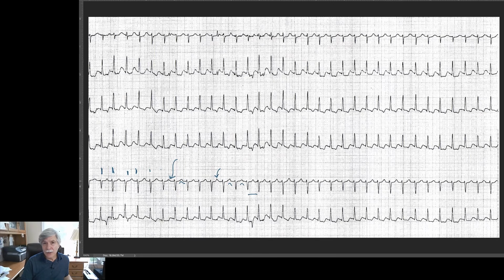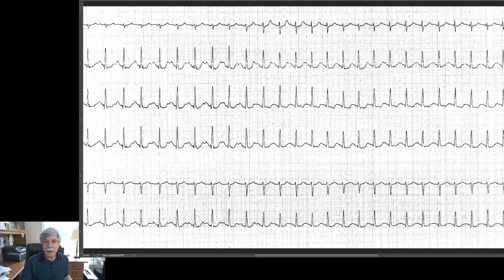But for the usual variety, the common form, what's also known as slow-fast, going down the slow and up the fast pathway, it's generally regular like a clock. So I was like, let's see what happens in a minute or two. And sure enough, with the patient sitting down, after a minute or two, the heart rate began to slow. And then we began to see the real truth here.